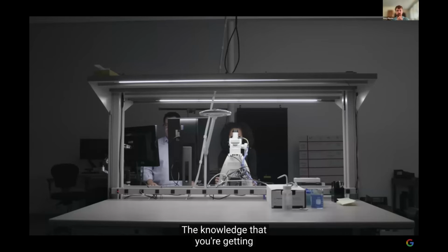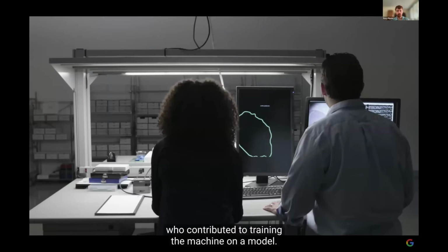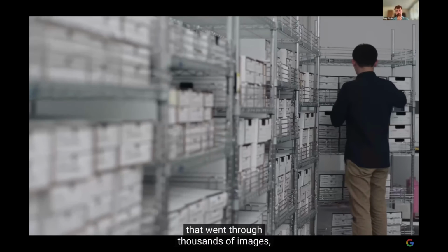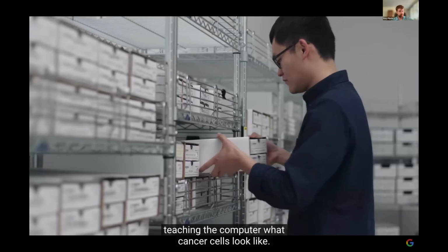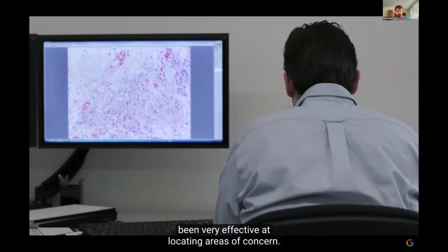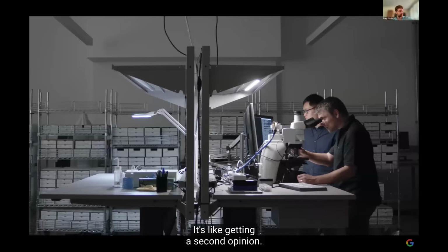The knowledge that you're getting when the microscope points out cancer to you is the knowledge of many pathologists who contributed to training the machine learning model. We had a team of pathologists that went through thousands of images, teaching the computer what cancer cells look like. I think it has been very effective at locating areas of concern. It's like getting a second opinion.